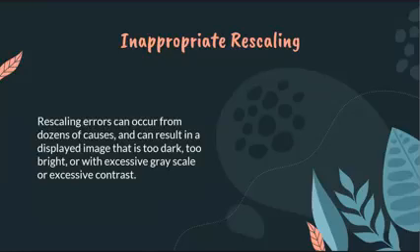So ganito siya. Okay, on the side of DR, it can be minimized, no, ang rescaling errors. Okay, when we say rescaling, we are adjusting the brightness or the contrast of the image. As I have said previously, di ba? When we rescale, sa previous natin na topic, we adjust the contrast or the brightness or both. So when we rescale in the DR side, okay lang siya because it does not affect the quality of the image, because ang gina-process ng computer is those that are exposed, no, ng mga pixels.